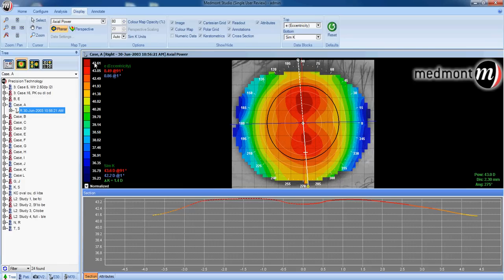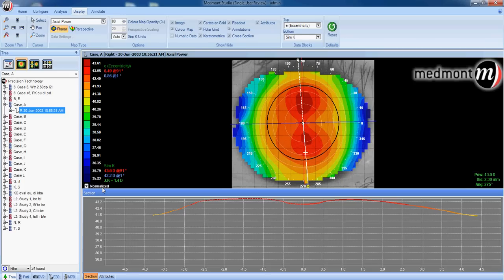The steepest it can read is 43.61 diopters here. The scale is set for a normalized scale range, meaning the topographer will show from the steepest to the flattest that can be read on the selected maps along this left-hand side.